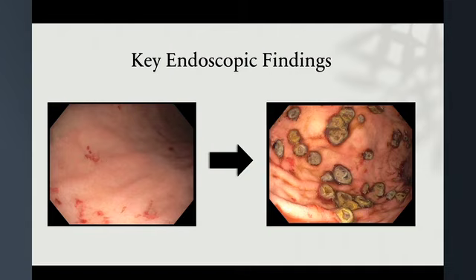The key point of this case report, and something important for us to take out of it, was, one, the rapid progression of the lung cancer and the gastric metastases. As mentioned previously, these two endoscopies were done 2 weeks apart, and there was a rapid progression in the gastric metastases. Also of note, something to take away, is how the gastric metastases appear on endoscopy. We would describe these lesions as bullseye lesions with central ulcerations.